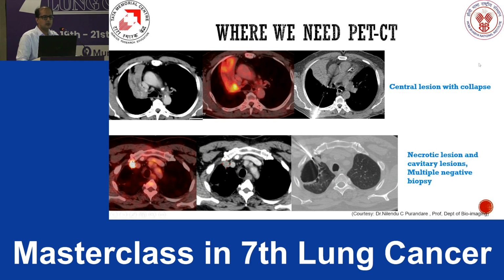Many times what we see on the PET, which would be the PET avid area, can be targeted with much better accuracy when we are doing PET guided biopsy. And this was again a solid nodule, and when we see the lung images, this was a cystic area which can be targeted easily.